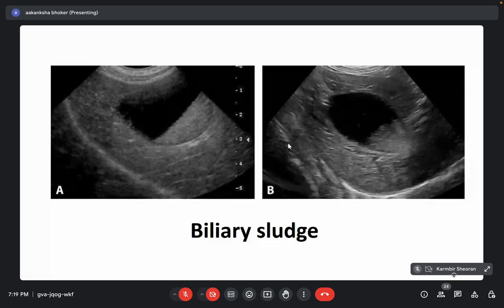Next, after the liver, we will talk of the gallbladder. See, this is a distended gallbladder. Again, here we can see a distended gallbladder. Its shape can be different, varying depending upon the level of distension. So here we can see there is presence of echogenic sludge, which is gravity dependent. It is settling towards the gravity. And this sludge can be an incidental finding, or it can be pathological. So suppose there is a geriatric dog. In those, we can see sludge as a normal finding, but seeing it in a very young dog, it can be associated with some pathology.